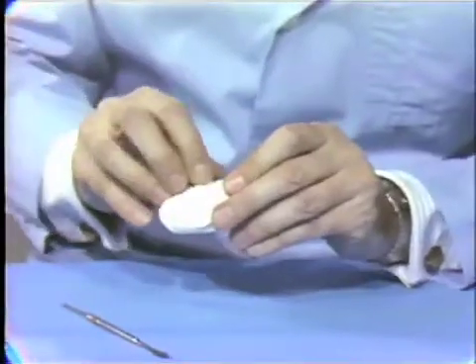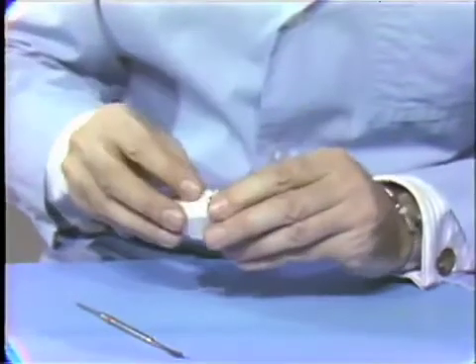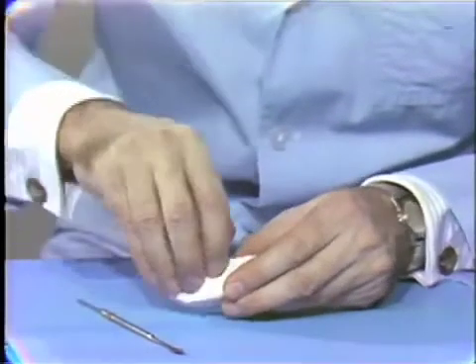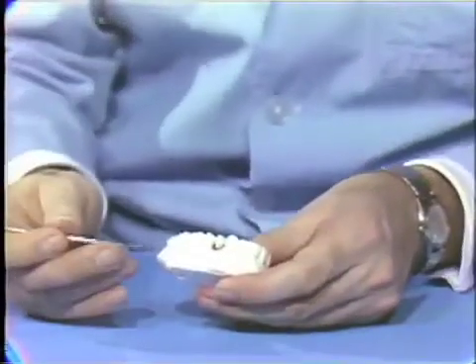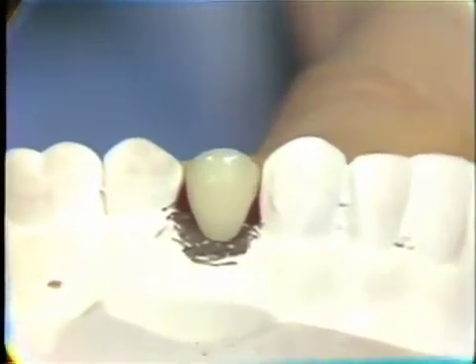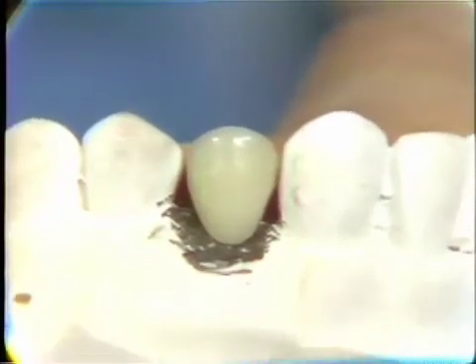Now we'll put that back on the model and see what we've achieved with that amount of grinding. Just takes a little adapting to get it back in the same relationship to what it previously was. I think if you take a close look at this now, you can see that those embrasures on the mesial and distal are somewhat more open than what they were. And that would be quite a satisfactory relationship for this particular case.